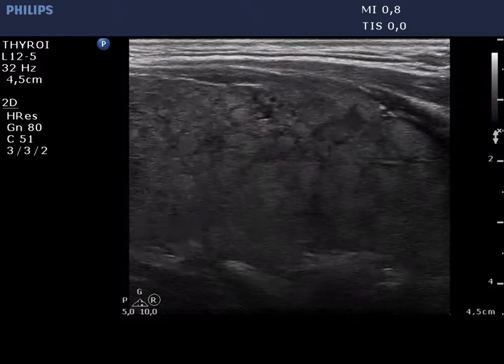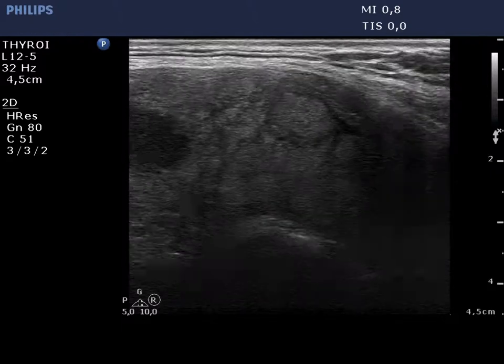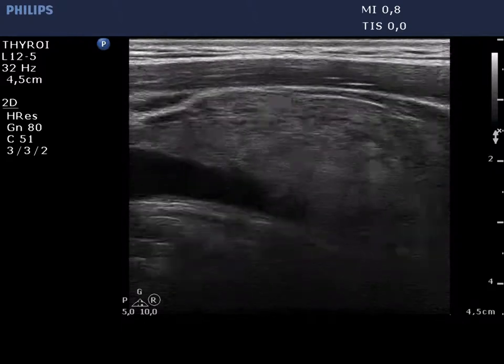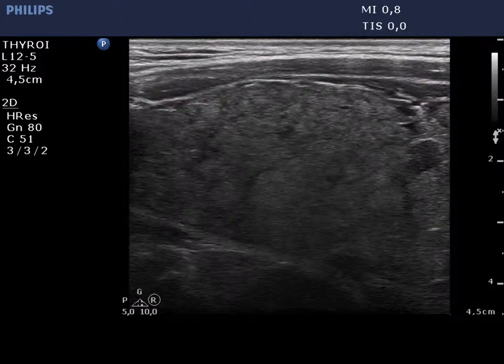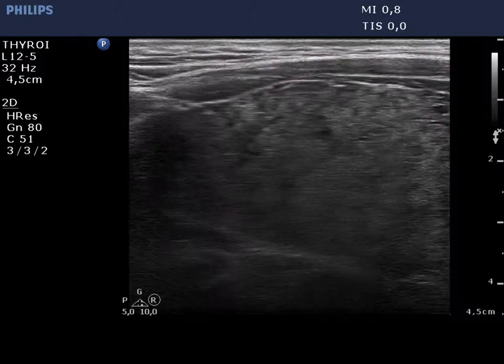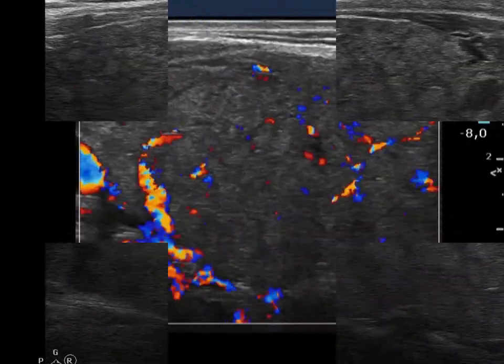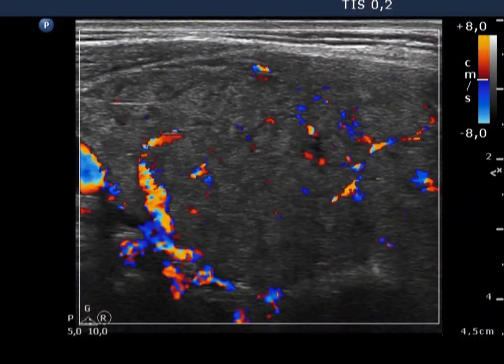This is the classical presentation of the so-called pseudonodular form of Hashimoto's thyroiditis. The thyroid presents periglandular blood flow.